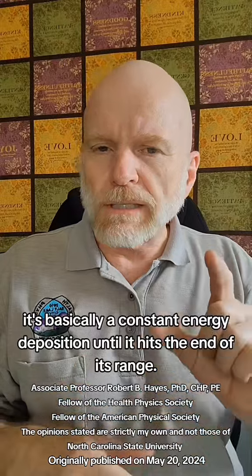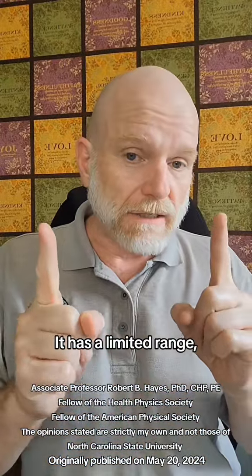Now, what's unique about proton therapy that you cannot do with photon therapy is something that's called the Bragg peak. With photons, you basically just have exponential decay through the body. So as the photon beam is coming into the torso, the intensity is going to exponentially decay as it passes through. With protons, it's basically a constant energy deposition until it hits the end of its range. It has a limited range.